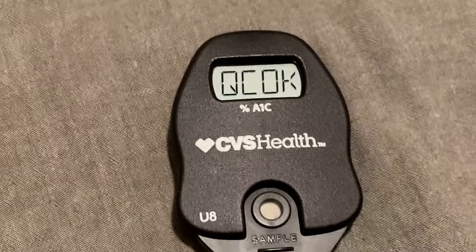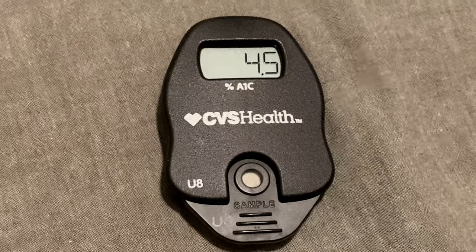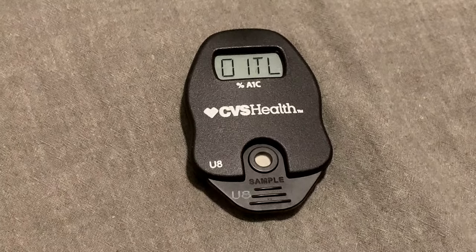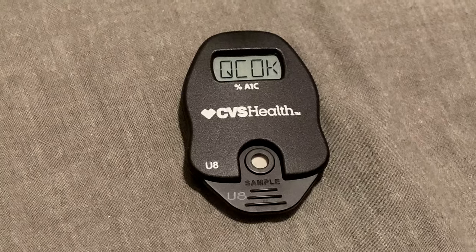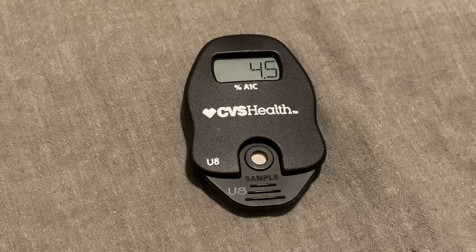Good, the quality control check went good. 4.5, excellent. That means the metformin's working. One test remaining, that's what that means. All right, well, there it is. So I'm going to record my data on that little piece of paper. That's how the test goes.